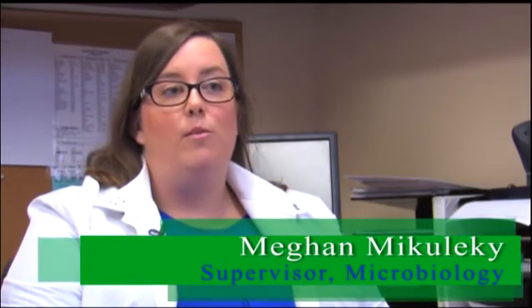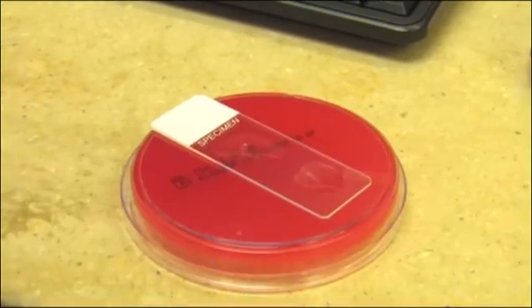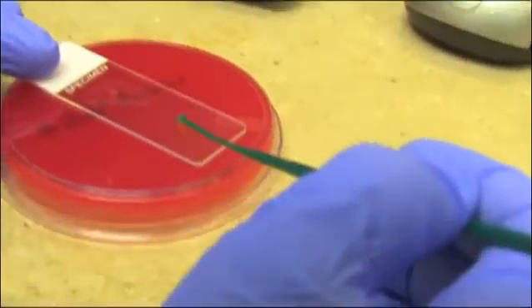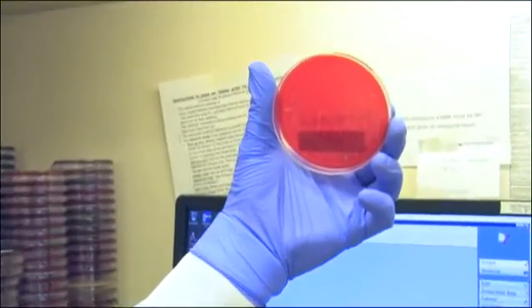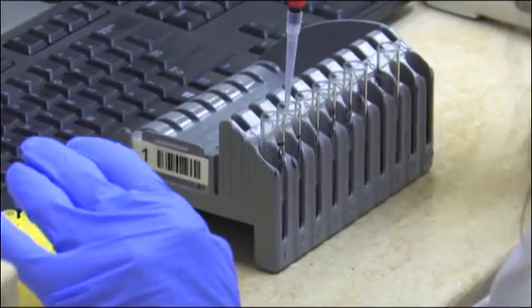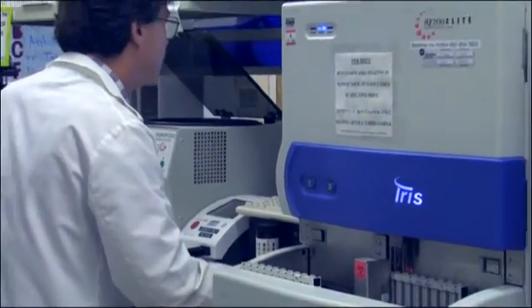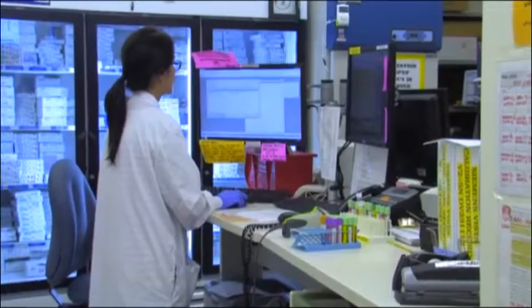Microbiology is a department within the laboratory, and what we do is we're looking for the bacteria that are making the patient sick. We will test the organism initially to see what kind of antibiotics are susceptible or resistant, which means susceptible will kill the bacteria, whereas resistant will not kill the bacteria. Depending on the pattern that we see, we'll set up additional antibiotics just to confirm our suspicions. As soon as we know that it's a resistant organism, we call the physician to ask if there are any other antibiotics they want us to run to see if those are susceptible.